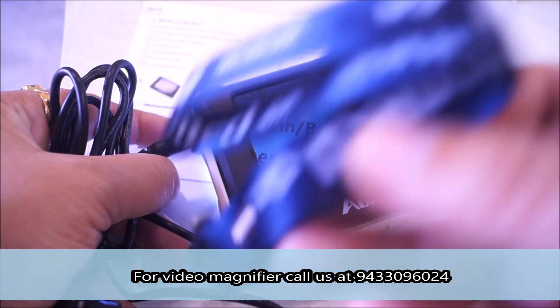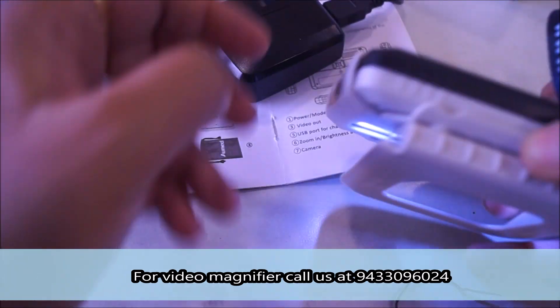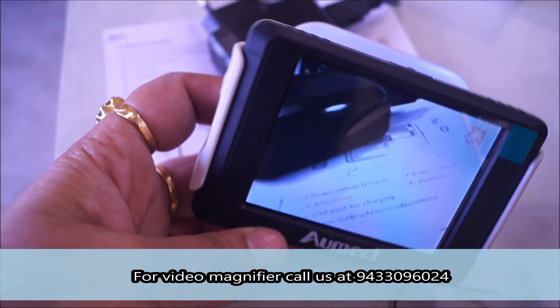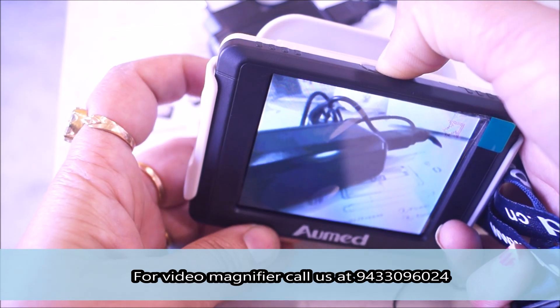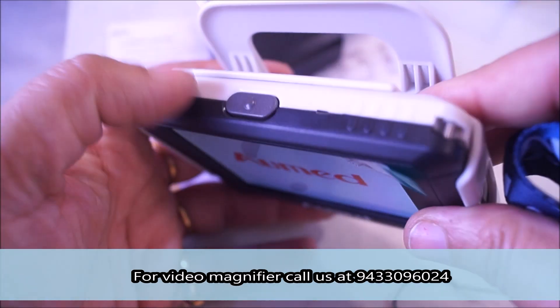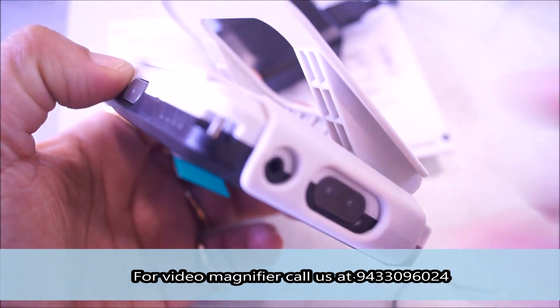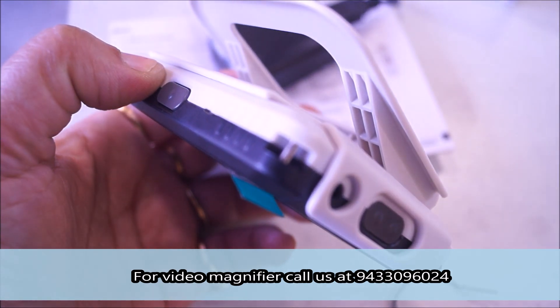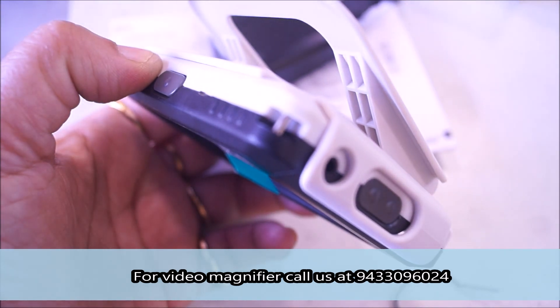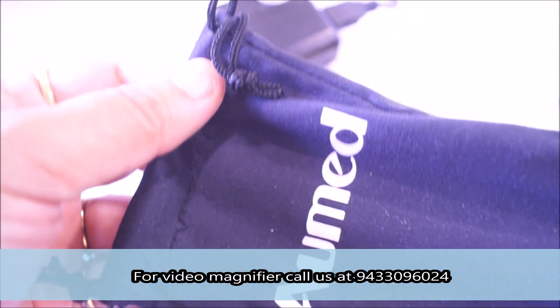Apart from this, you also get a clip so that you can hold it in your hand comfortably. You can clip it onto the device. Apart from this, you also get a bag — you can put the device in it and carry it around.